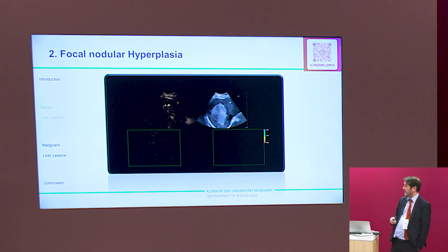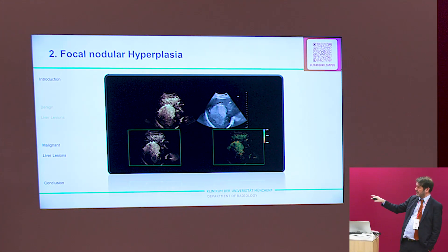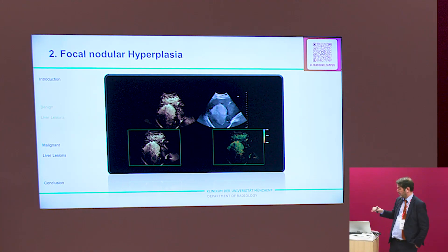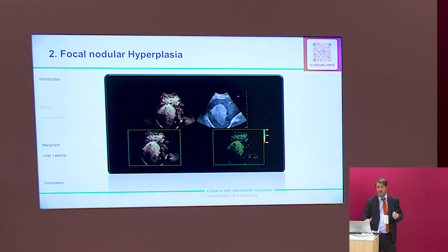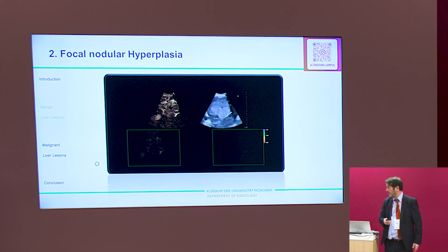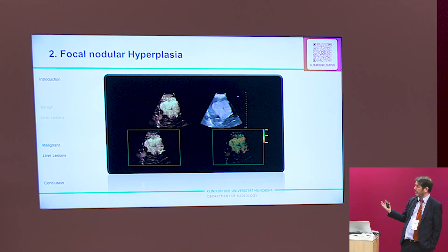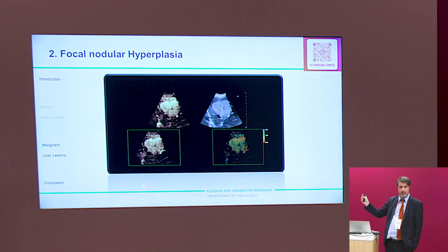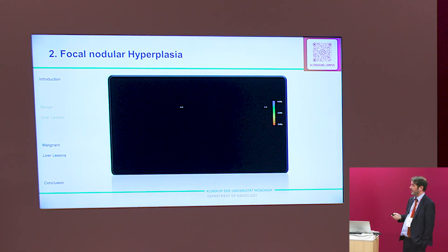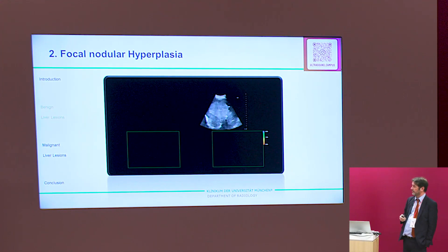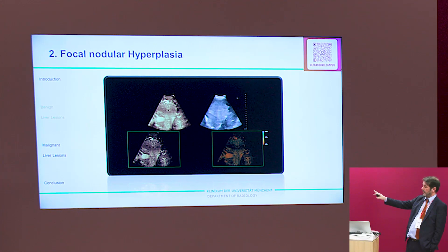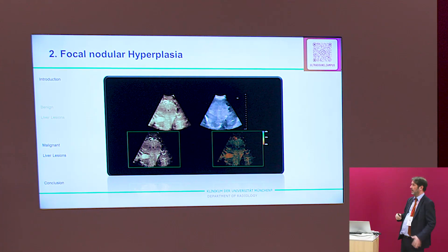Now I show you the new technique. You see the strong uptake and also the time-of-arrival map — red in the center means the first bubbles arrive in the center. This is the central feeding vessel. If we destroy it and look later, you still see the refill — typical behavior of FNH: tiny vessels but strong uptake. In the late phase it is still hyperenhancing — typical pattern for FNH. You can combine conventional color Doppler, grayscale, contrast, and both new settings: either high resolution or time of arrival in a four-panel view.